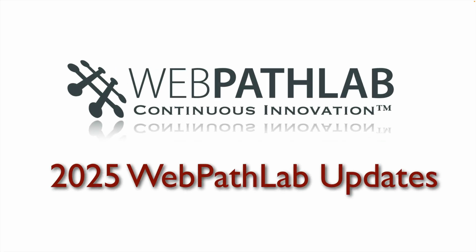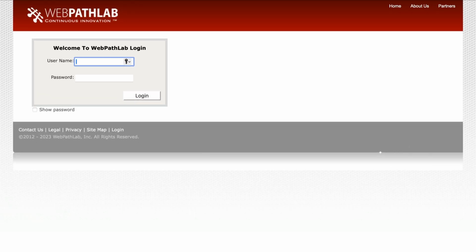Welcome to the 2025 WebPathLab Update Summary. We begin by logging into WebPathLab and landing in the My Cases page.